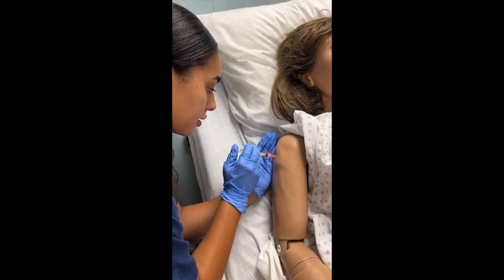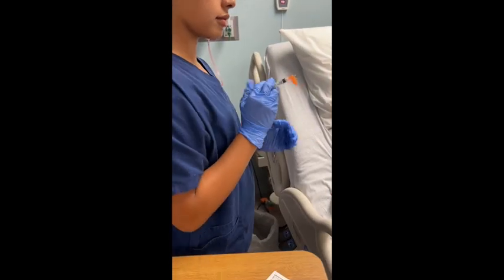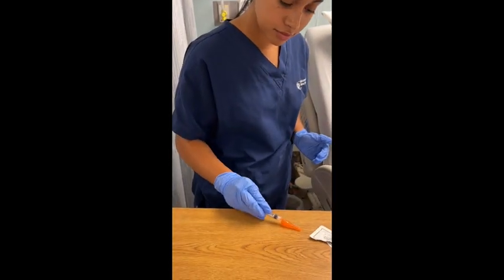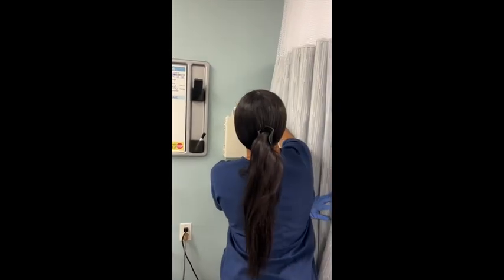Withdraw the needle quickly at the same angle you inserted it. Apply gentle pressure at the site, but do not massage. Activate the needle guard and dispose of it in the sharps. Perform hand hygiene and document according to best protocol.